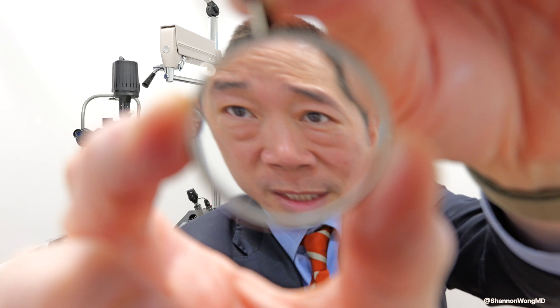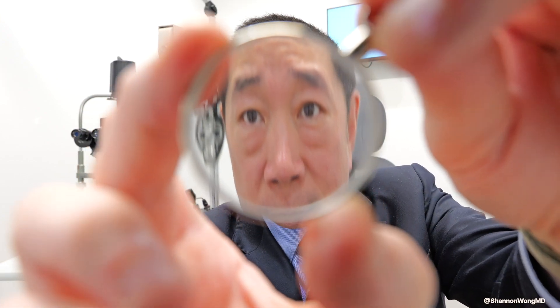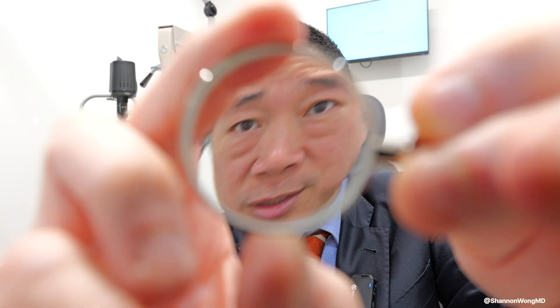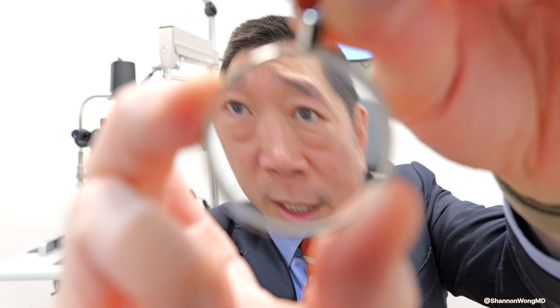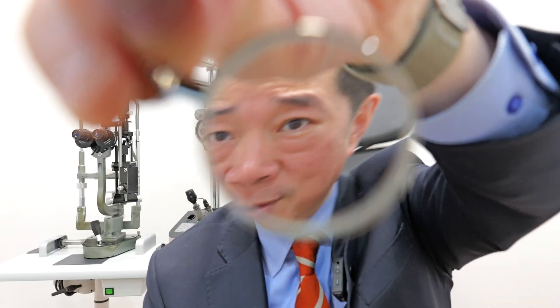Just for reference, this is an astigmatism correcting lens, and if we rotate it, you can see how the vision changes. That occurs with contact lenses that correct astigmatism if they are not properly aligned on the eye, and it occurs for lens implants placed into the eye.